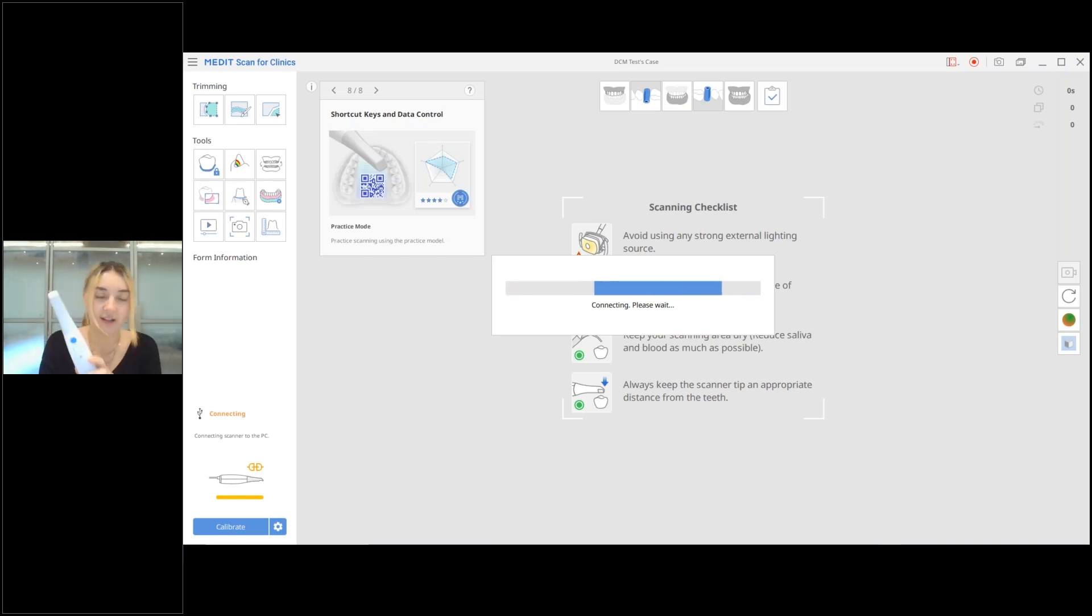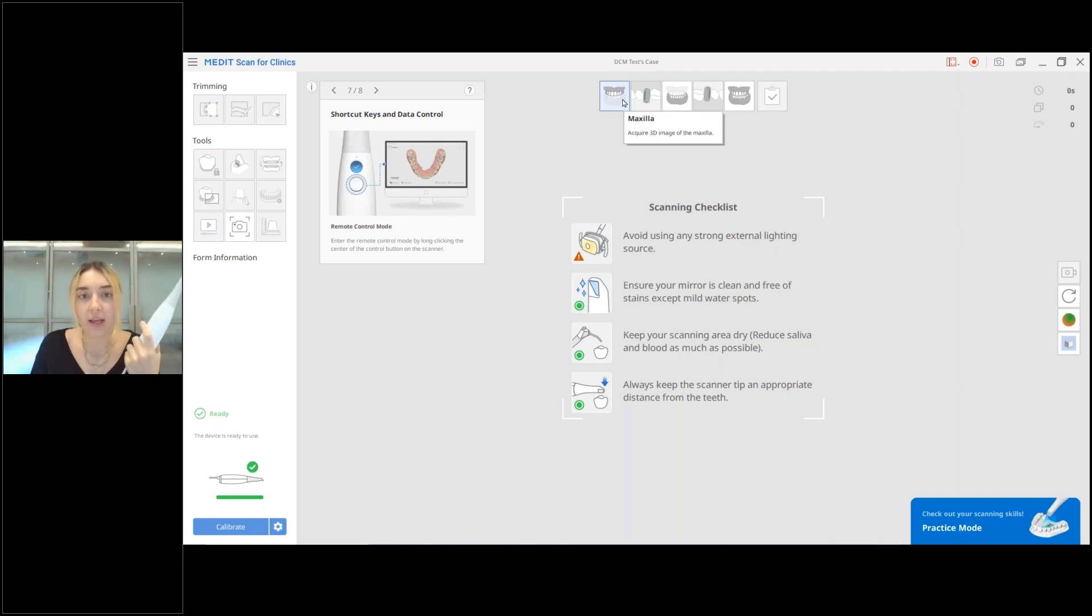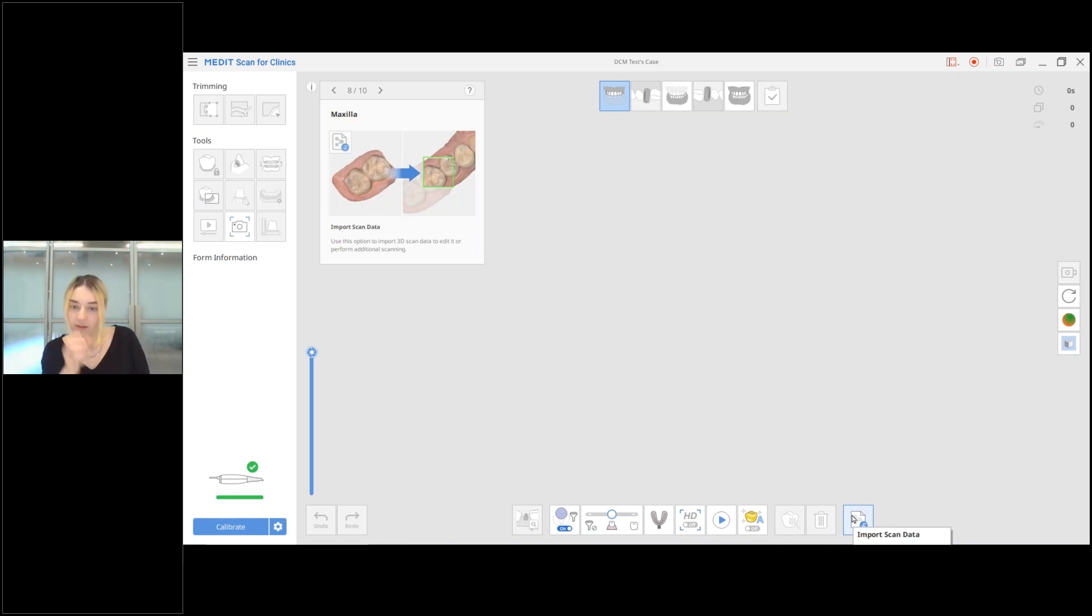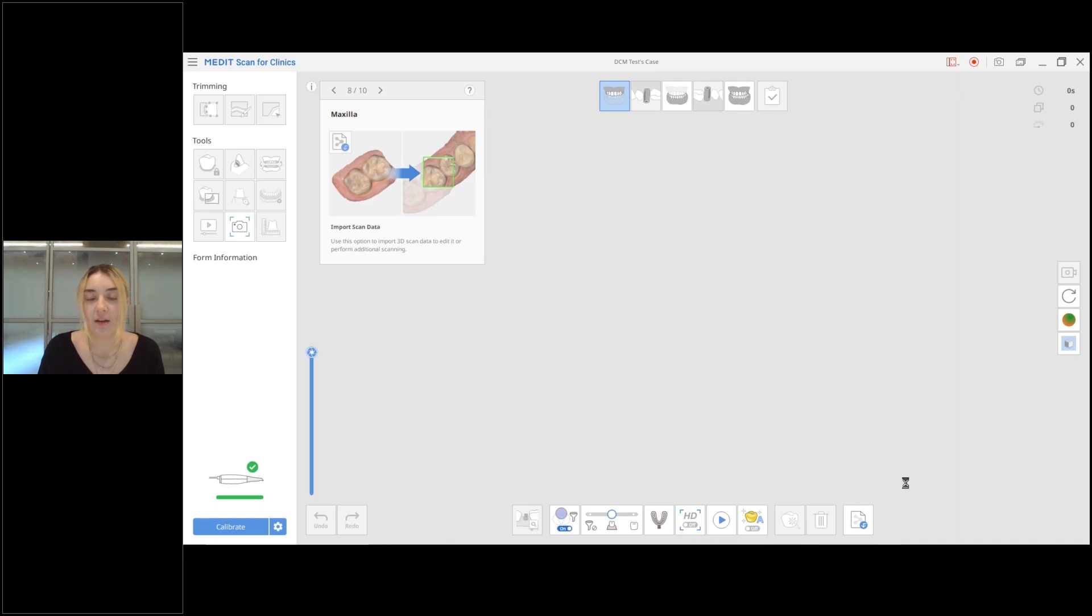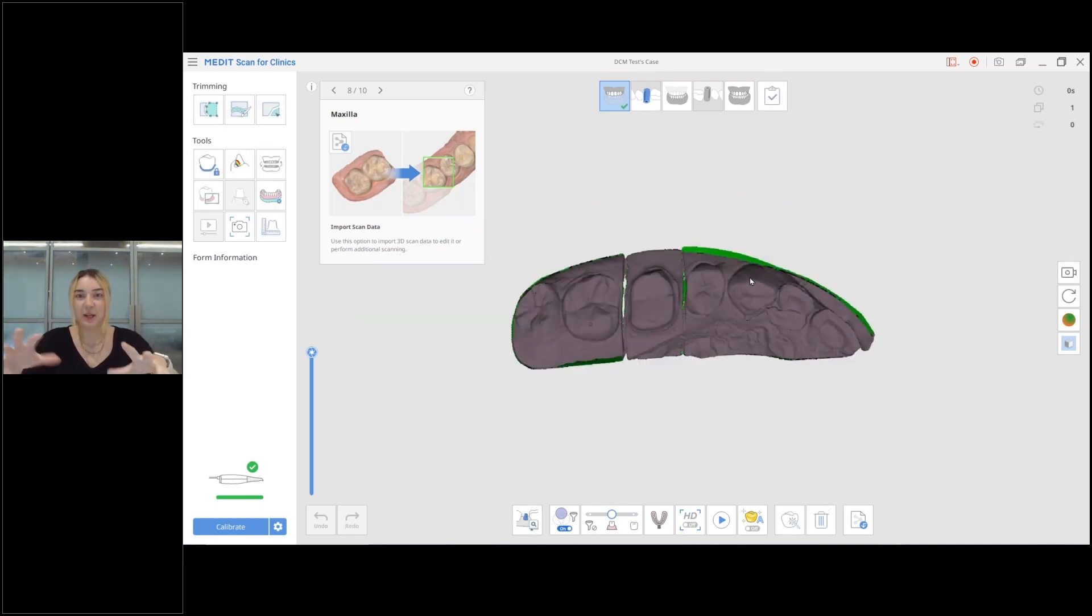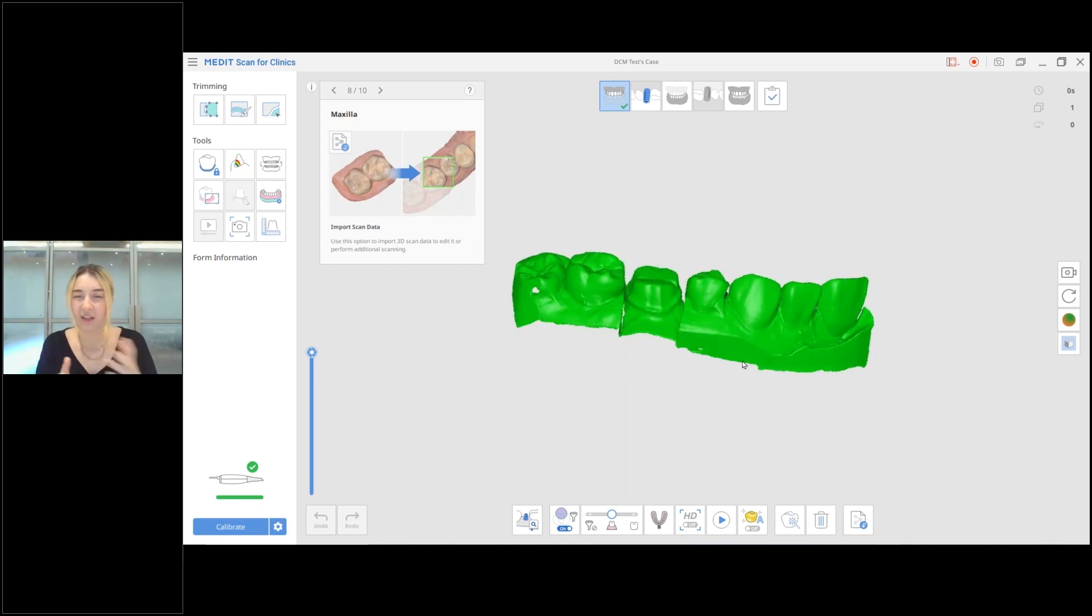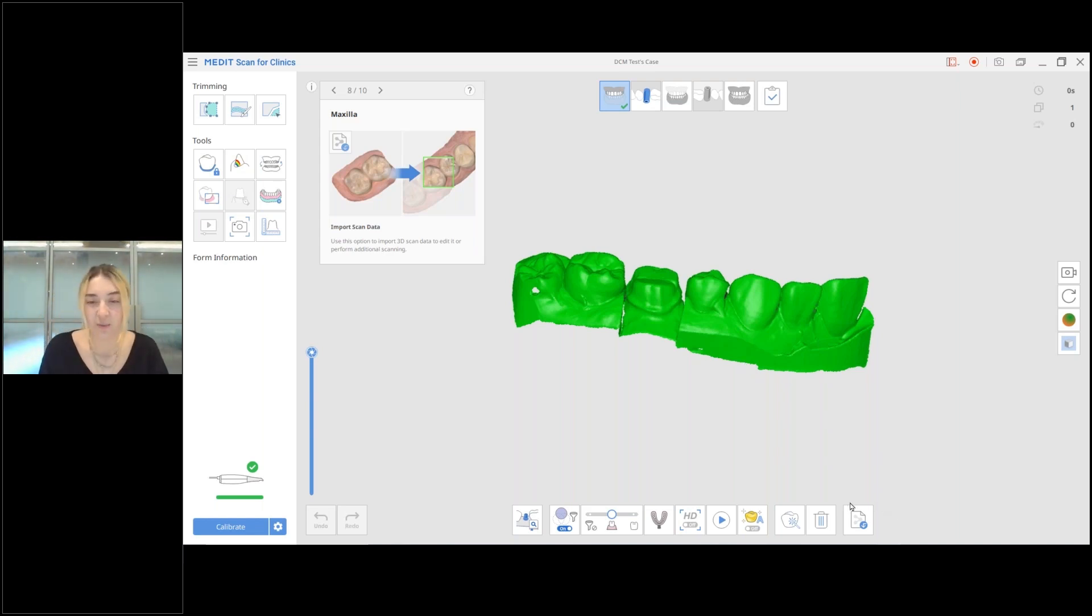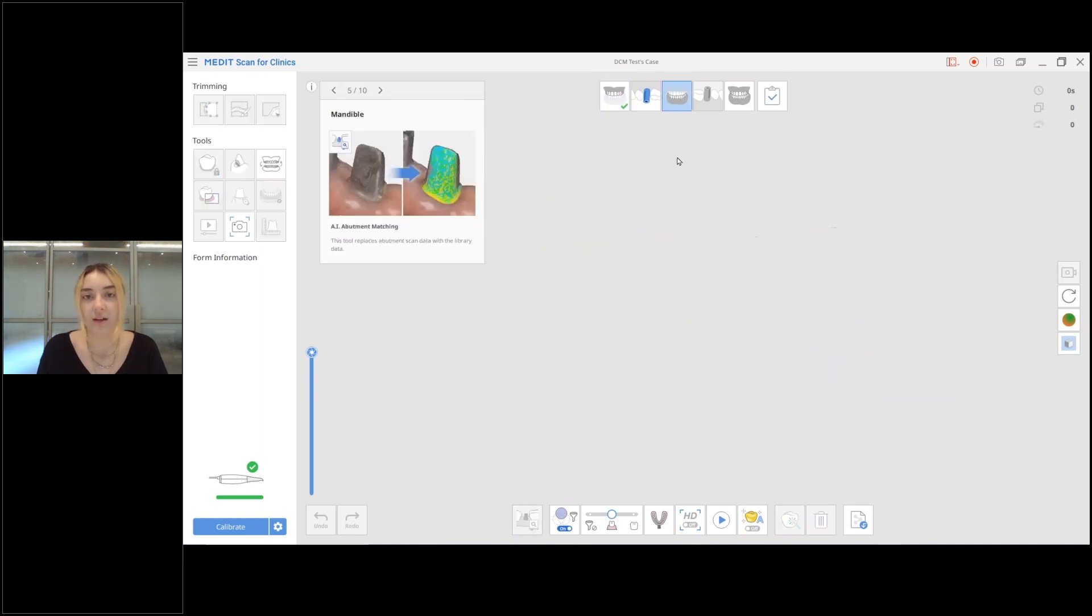If you hover over, you see that the file extension is mid mesh. What I'm going to do now, I'm going to press the scan button and open Scan for Clinics as usual. Here I have my scanner with me, my i700. Everything that we do supports both scanners, i500 and i700. Next time if there's something to scan I'm just going to bring my i500. I go to maxilla stage and I press this button. This button allows me to import scan data from my MediLink case.